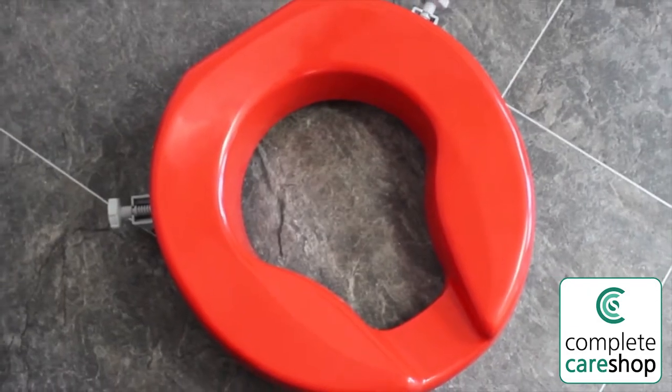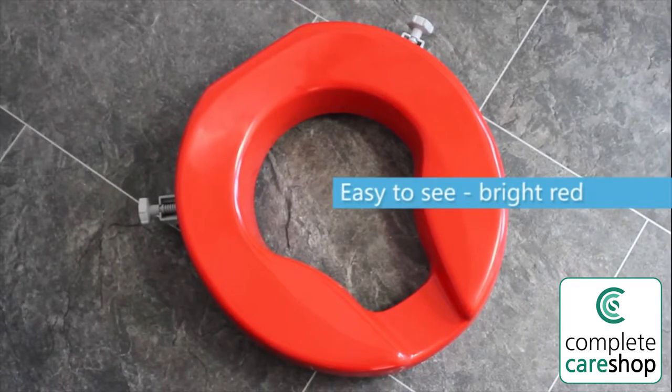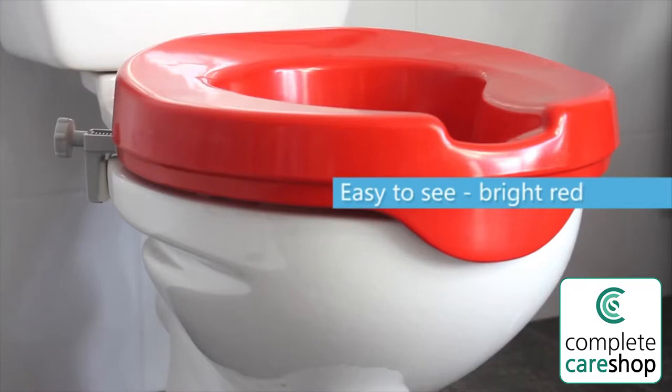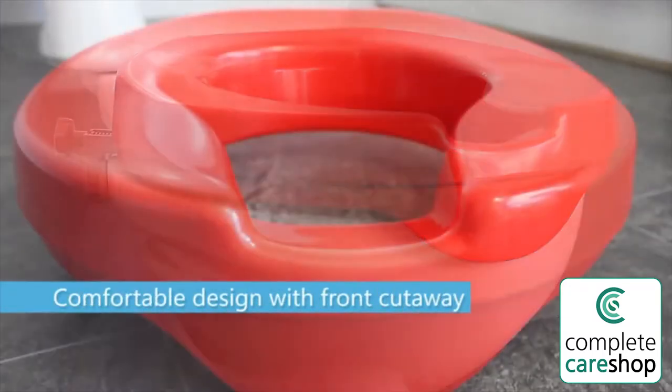Red raised toilet seat. This raised toilet seat makes it easier for you to get on and off the toilet with less bending required. It is bright red so is easy to see on a white toilet, and features a front cutaway for easier personal cleaning.